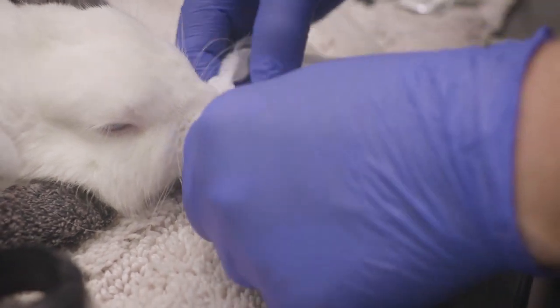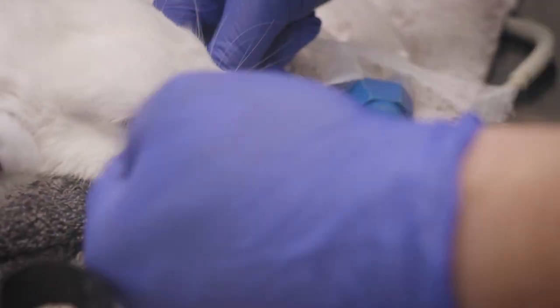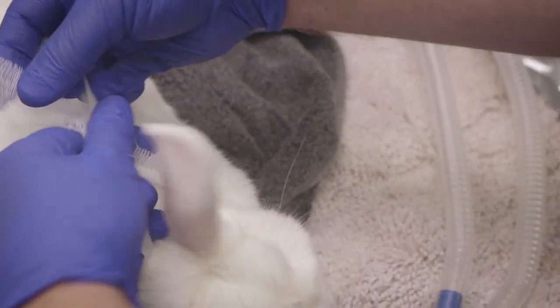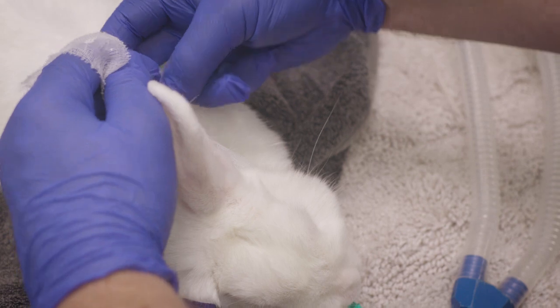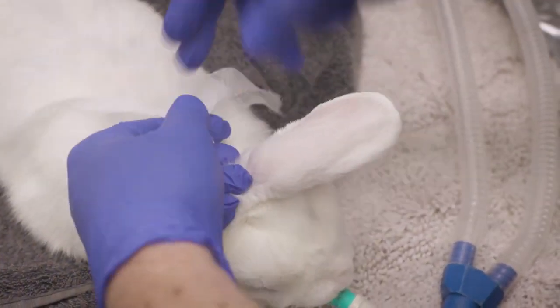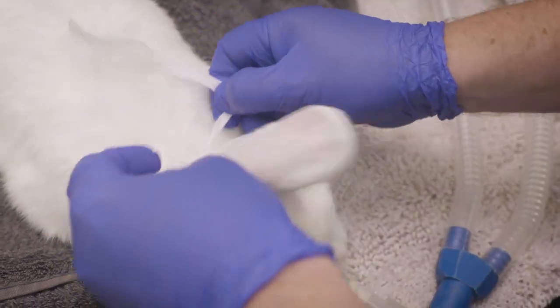The V-Gel should be secured into place by tying a gauze fabric strip, IV line or string onto the raised ring features on the V-Gel. It can be wrapped around the small connector wings for extra security. The tie should then loop around the back of the patient's head, thus allowing no rostral movement of the V-Gel.